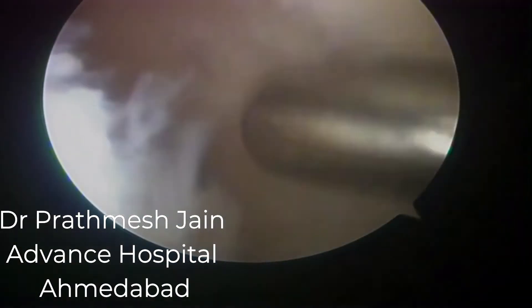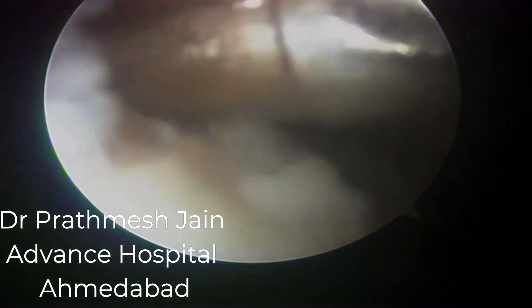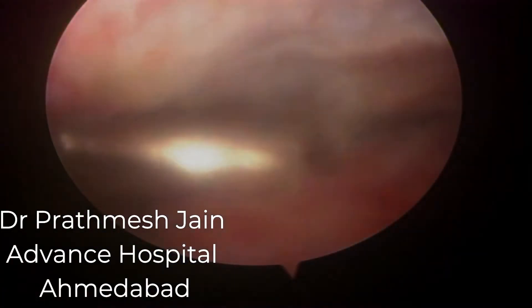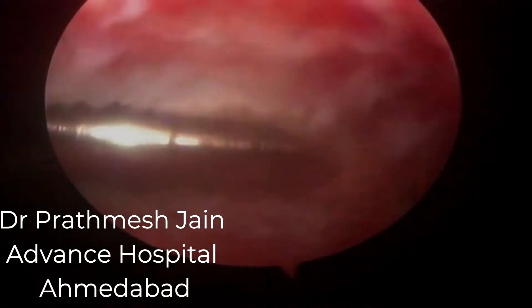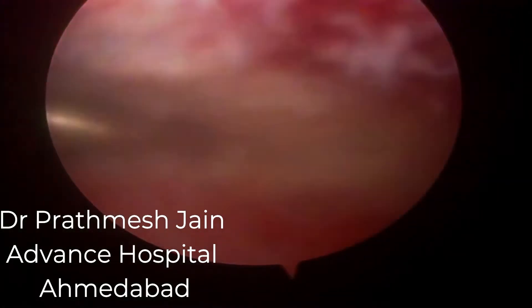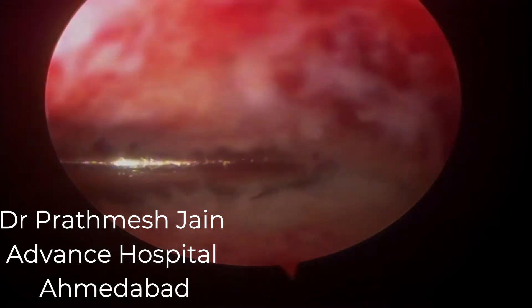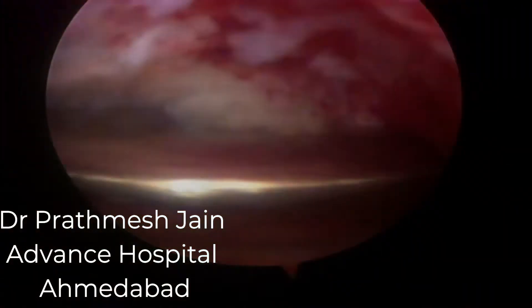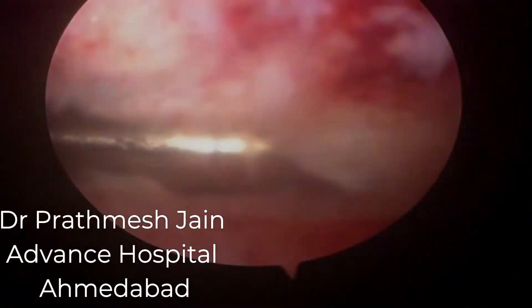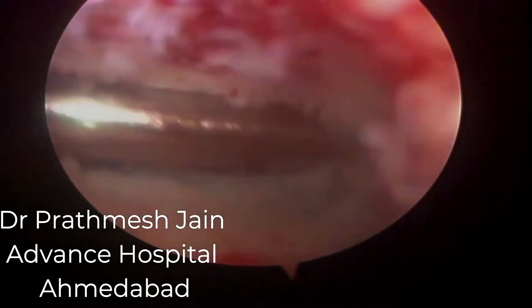We proceed from distal to proximal. We release the tissue on the distal aspect and intercondylar notch first, then go proximally and into the suprapatellar region. The suprapatellar pouch normally has very dense adhesions and is usually hyperemic. You must understand that these are very inflamed, highly vascular knees and there may be a lot of bleeding during this stage.